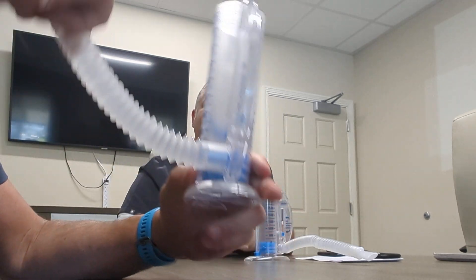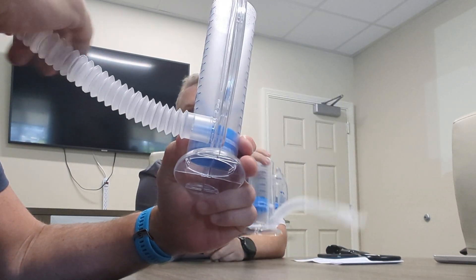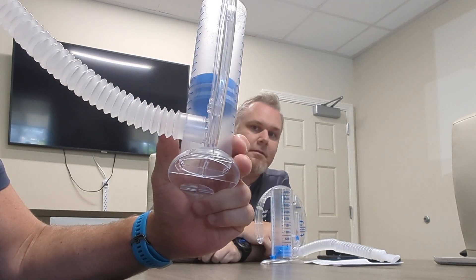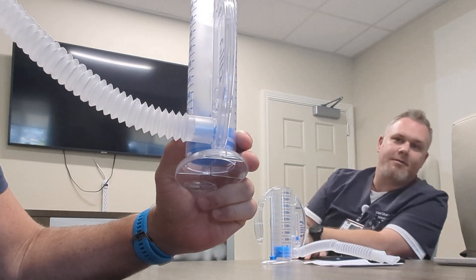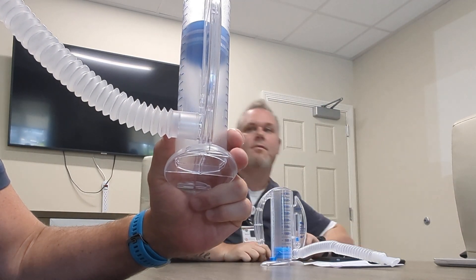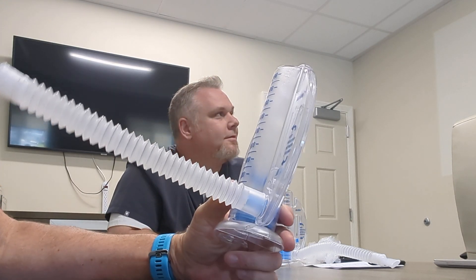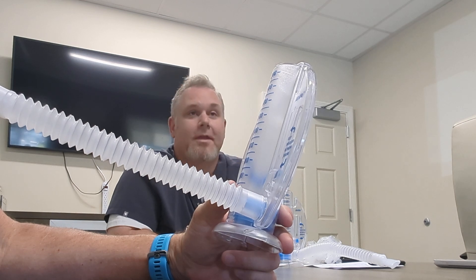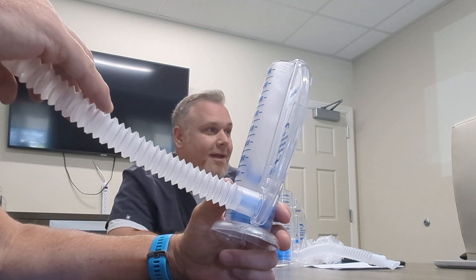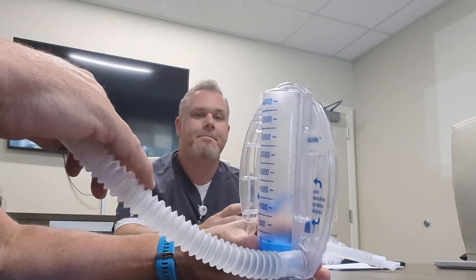You can lift it - do whatever you want. See, it doesn't work upside down. He got to about 2,500 on one breath. Did he do it correctly or incorrectly? What would you change? You have to start at the end of expiration - you have to dump everything out first, then take your breath. But overall that was actually a fair effort.